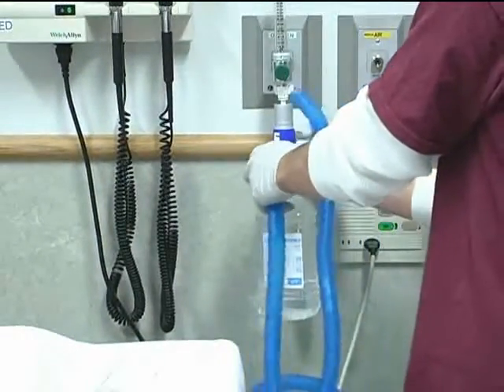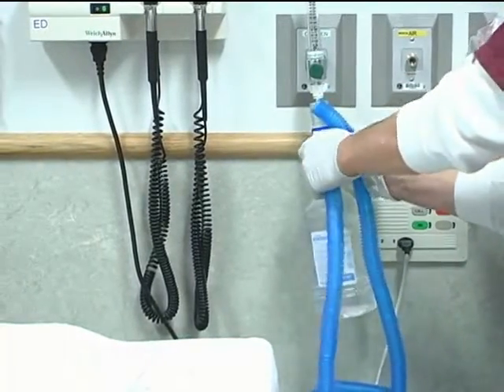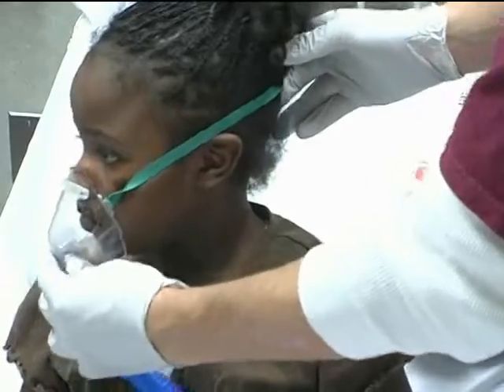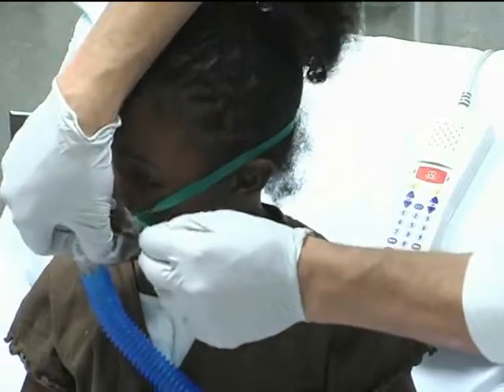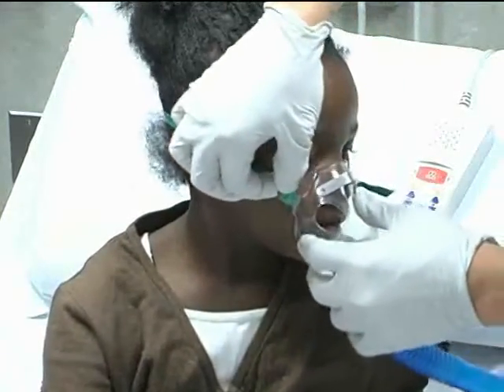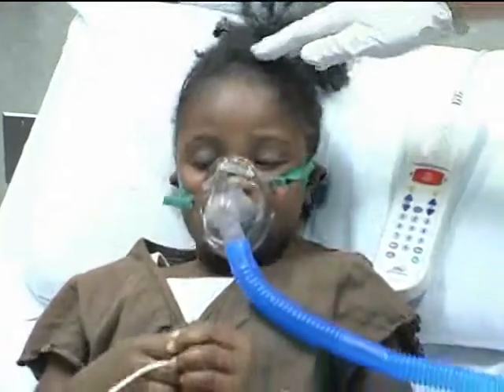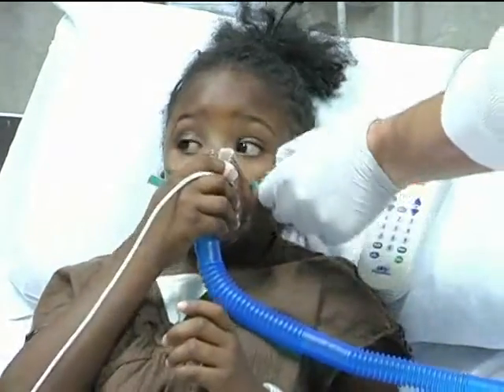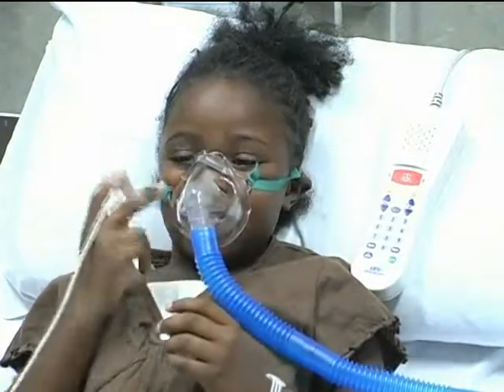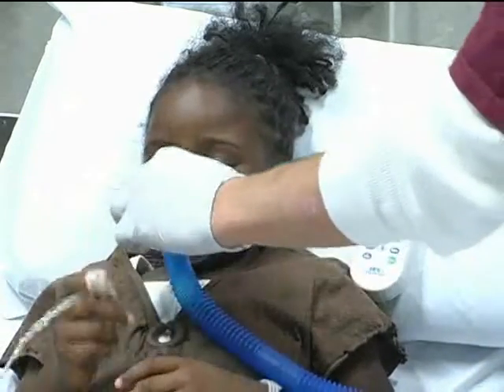The simple face mask is connected to a continuous oxygen source with humidification via corrugated tubing at this institution. The mask should be fitted around the skull with the use of adjustable straps to find the best fit. The mask can be fitted on the nasal bridge by gently pinching the adjustable metal band. A properly sized and fitted mask should cover the nares and mouth without covering the eyes or hanging below the chin or jawline.